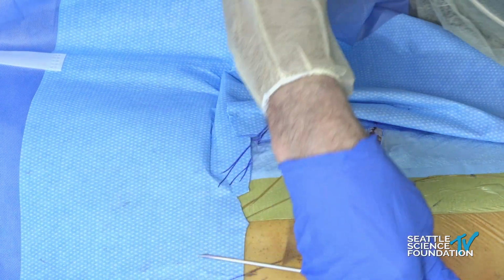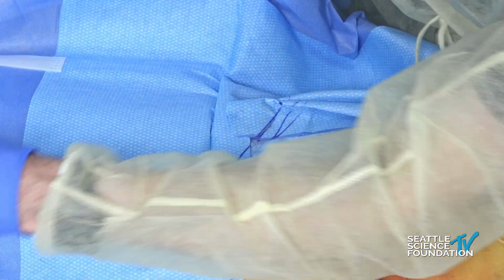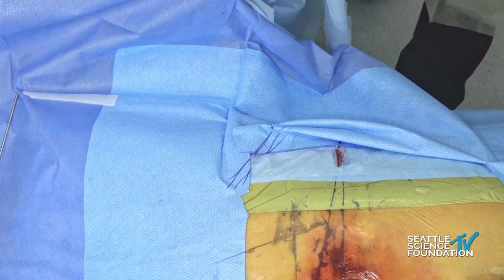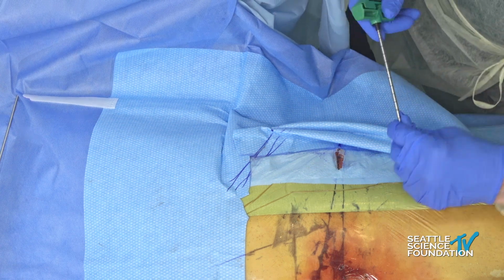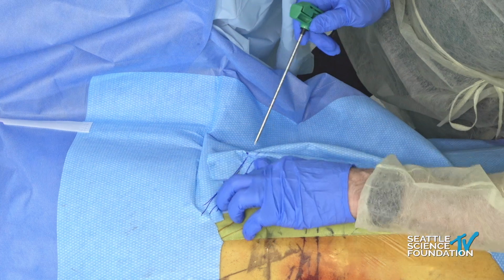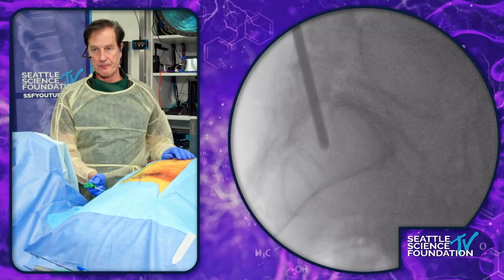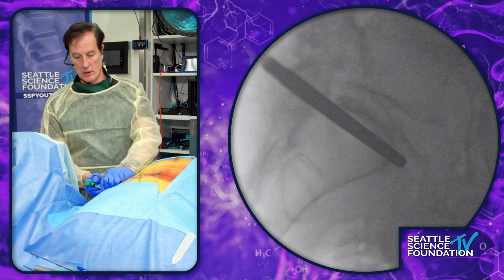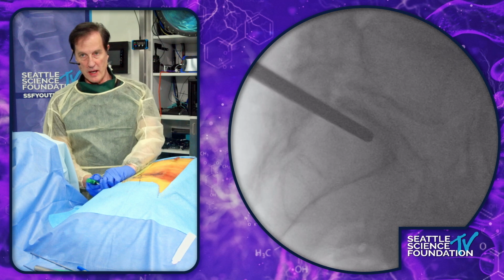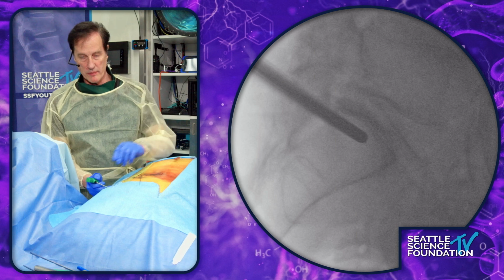And so we always start with rigid access. These are Steinmann pins, they have some give to them, but I really prefer to start out with rigid access. All right, picture here. So we will find the mid-body of S1, picture.